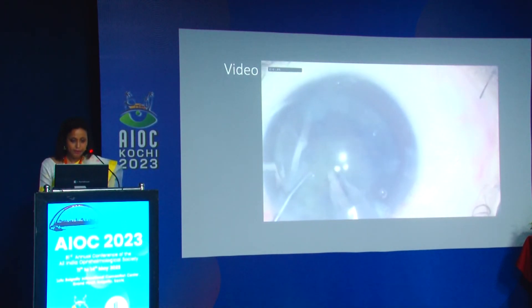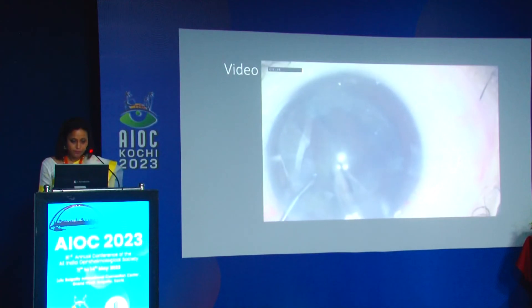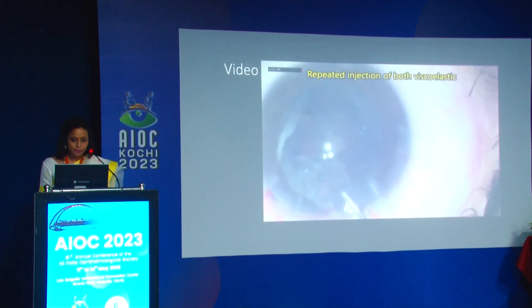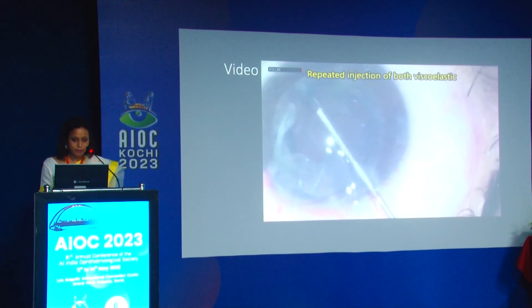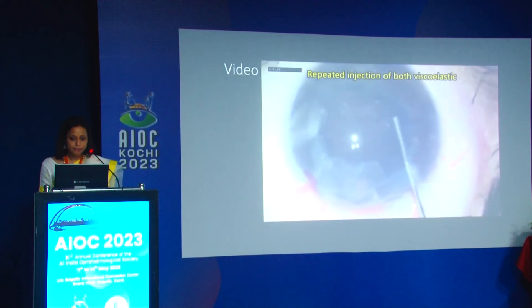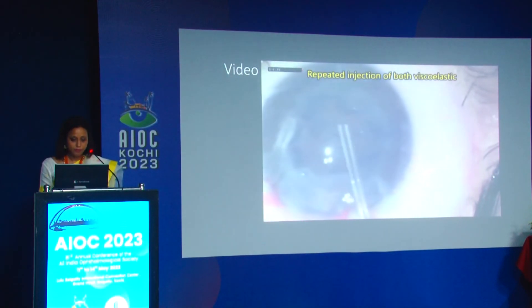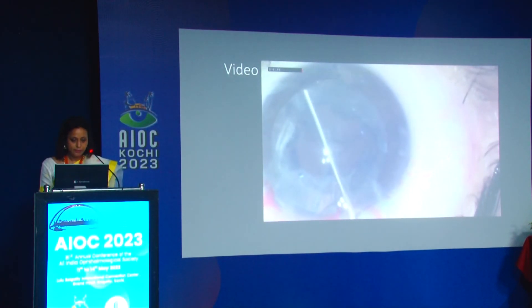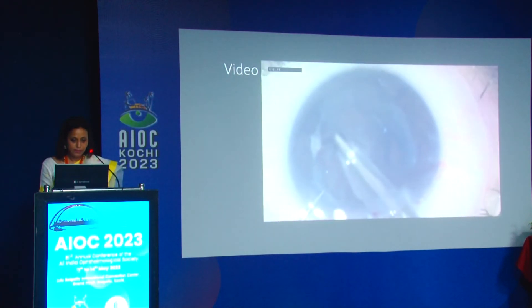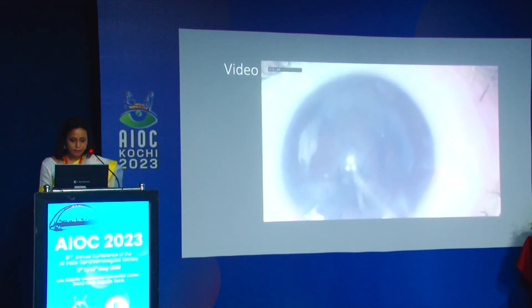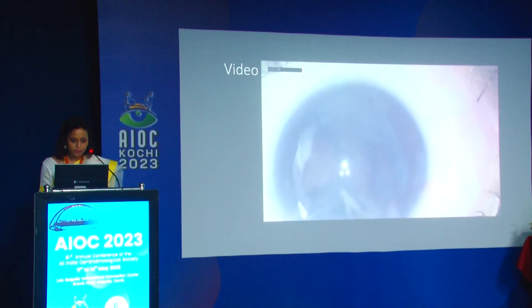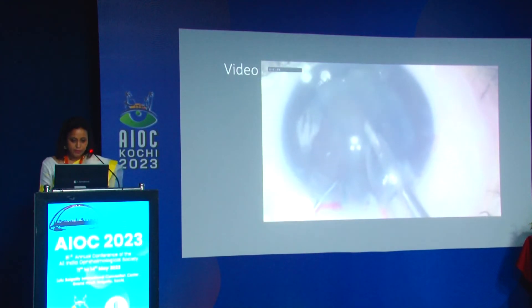Keep movement to a minimum and perform repeated injection of viscoelastic — I cannot highlight this enough. The soft shell technique using both cohesive and dispersive viscoelastic is essential. Routine epinucleus removal is then performed, followed by cortical wash.